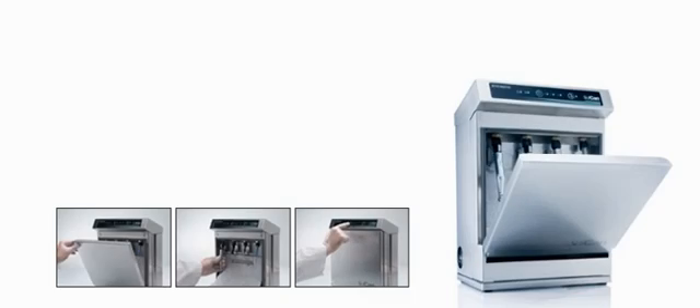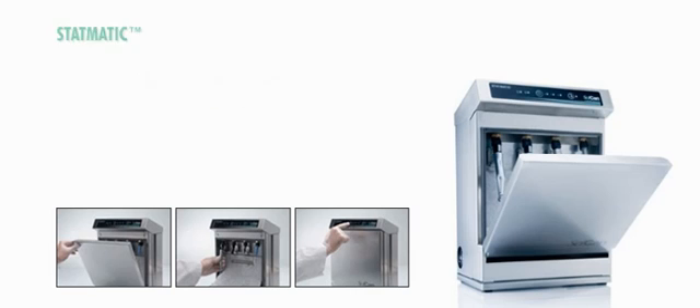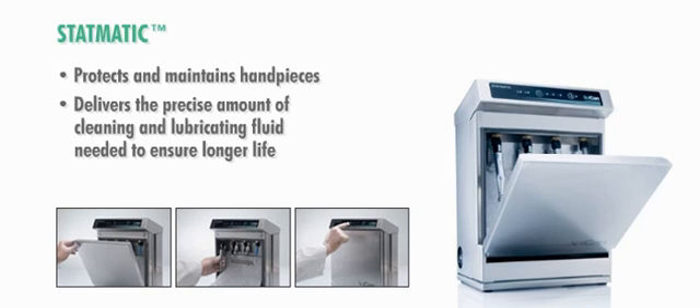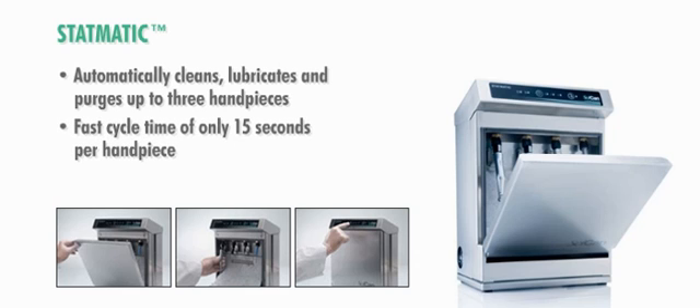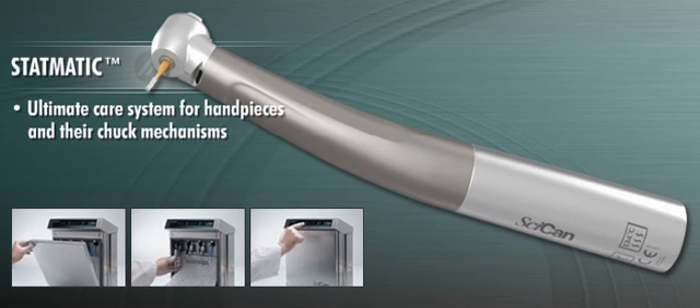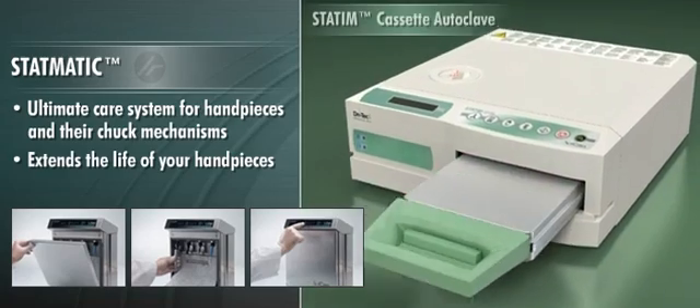If not properly cleaned and maintained, even the finest handpieces will wear out sooner than they should. SciCan STATMATIC protects and maintains your handpieces by delivering the precise amount of cleaning and lubricating fluid needed to ensure longer life. STATMATIC automatically cleans, lubricates, and purges up to three handpieces with a fast cycle time of only 15 seconds per handpiece and includes a maintenance mechanism that provides the same protection for the chuck. The ultimate care system for handpieces and their chuck mechanisms, STATMATIC extends the life of your handpieces, especially when used in conjunction with a STATIM cassette autoclave.